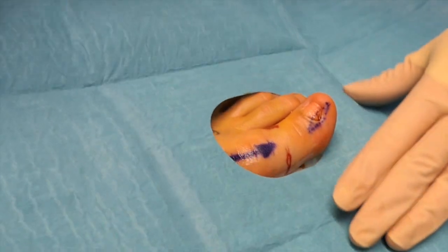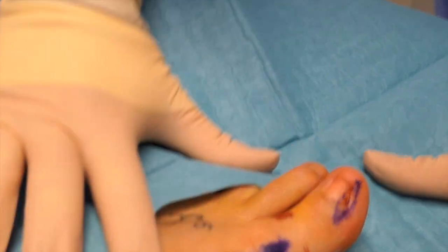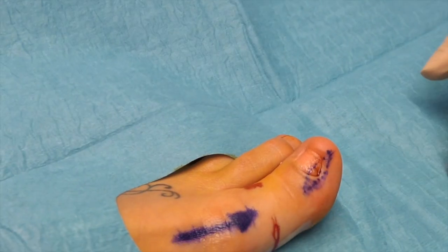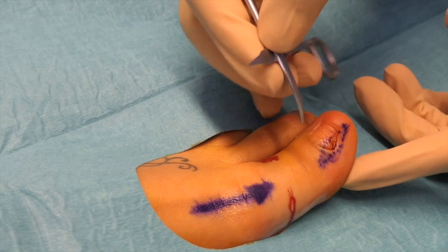And just isolate the toe. So this being an incisional technique, we like to do under somewhat aseptic conditions, so we're in theatre today. First thing we'll do is just check that the anaesthetic that's already in has worked.